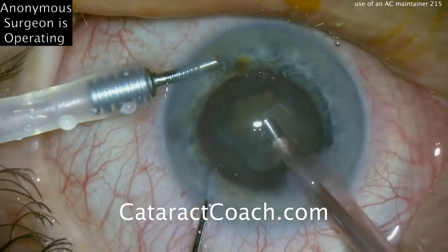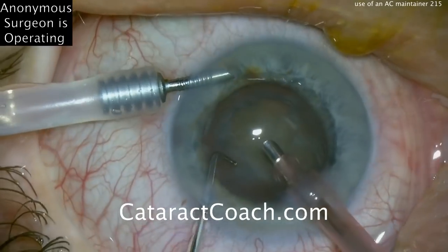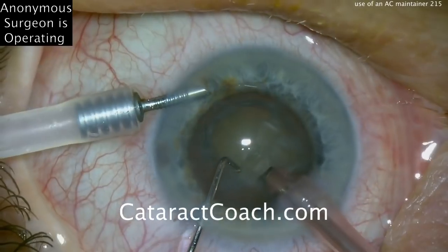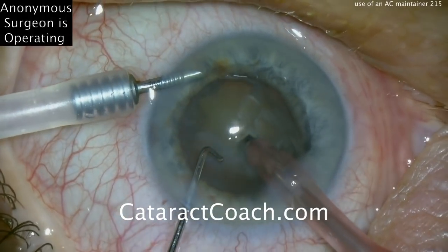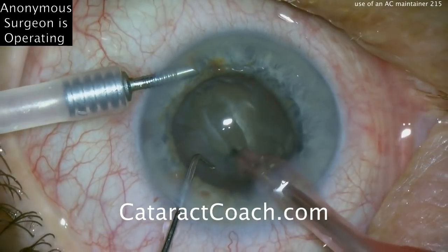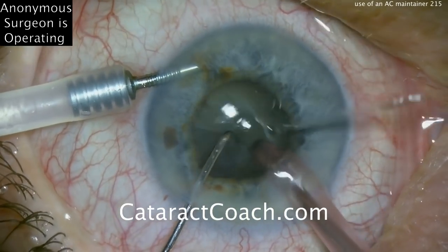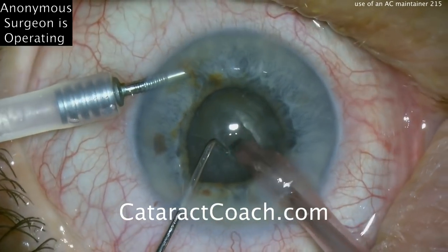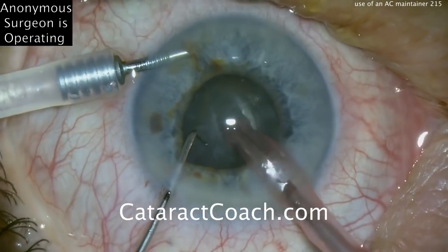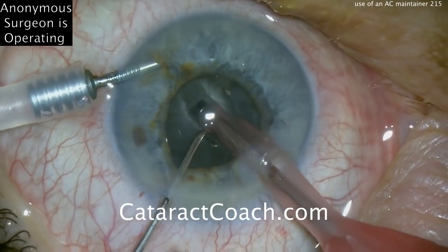Phaco probe going in the eye, cleaning up a little of the anterior cortex, and an attempt is going to be made here to remove this nucleus — chopper going in the eye as well. Looks like we're grooving a central trench here. The anterior chamber maintainer makes life a lot easier because it keeps the AC pressurized at all times, so even if there's distortion or leakage from the incision, that'll help maintain the AC. Again, a central groove is being created.